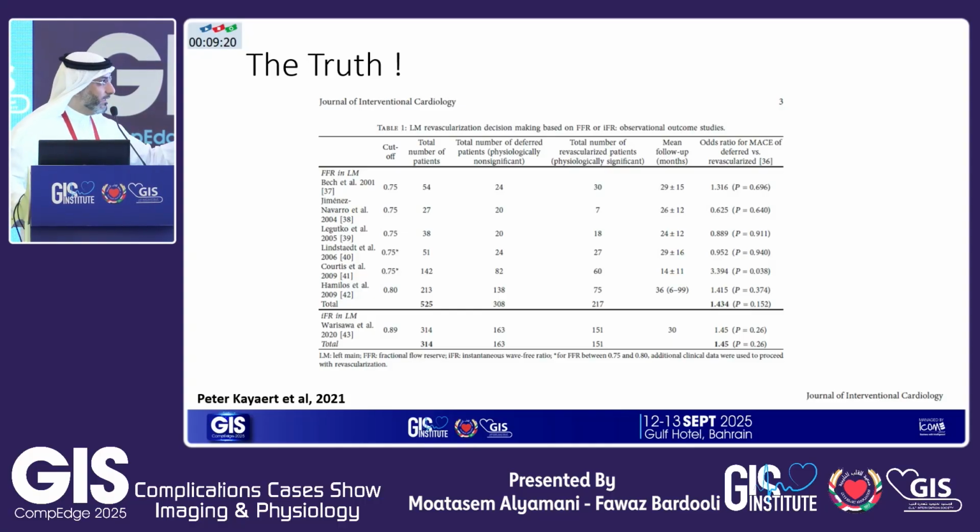However, despite that, some studies were done in the left main with physiology, but as you can see, the numbers are small. For FFR, it's only about 500 patients collectively in all the studies, and for IFR, there's only one study that looked at 300 patients. So it's not very robust evidence for physiology in the left main. You can understand why.